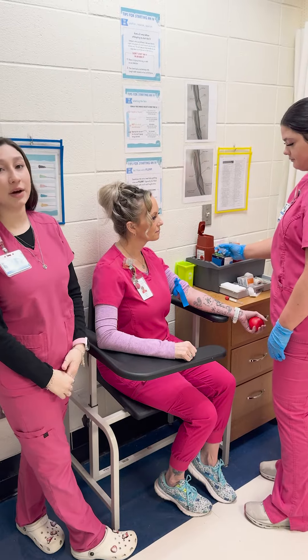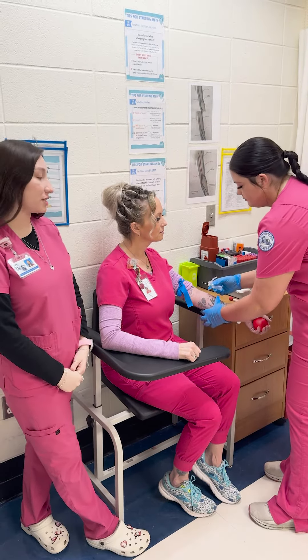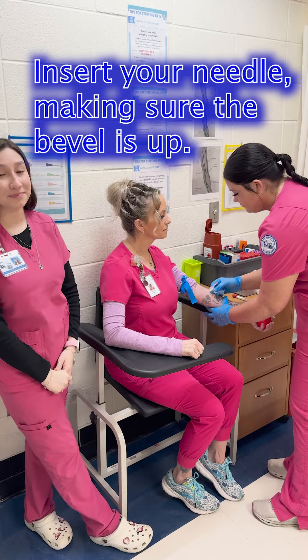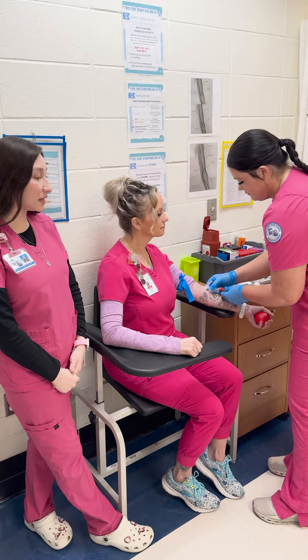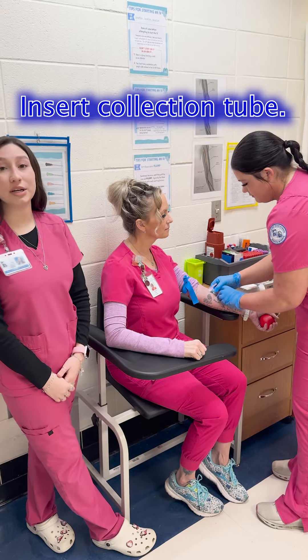Once your tourniquet kit is reapplied, go ahead and start the needle insertion, making sure that the bevel is up. Once the needle is inserted, you're going to go ahead and insert your tube into the hub.